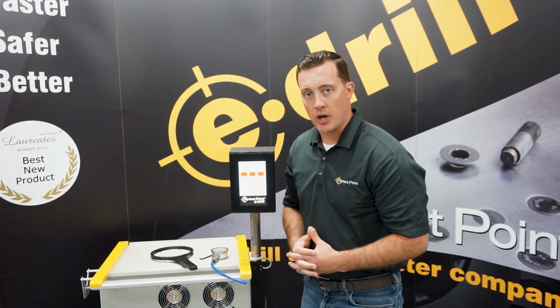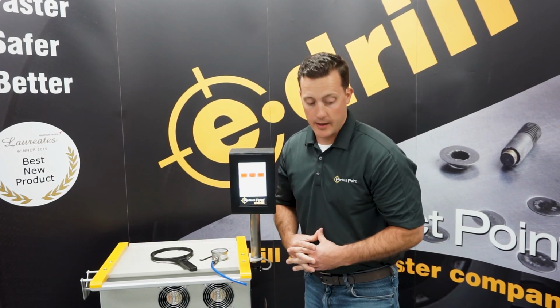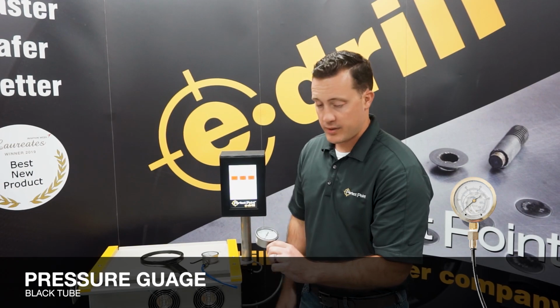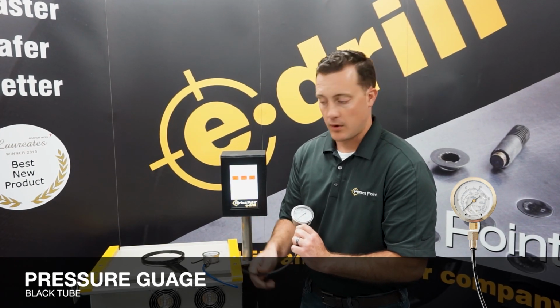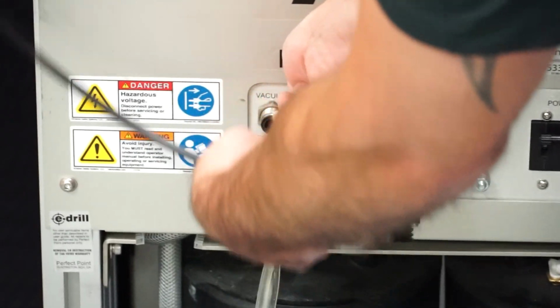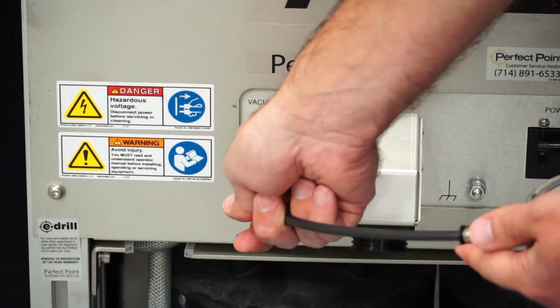Now's a good time to check our pressure in the system, make sure that we're reading our good pressure, which is 80 PSI. So now we got our pressure gauge. Again, PSI, black small tube. To put this one on, I'm gonna disconnect our vacuum and pressure, install it into the pressure side.